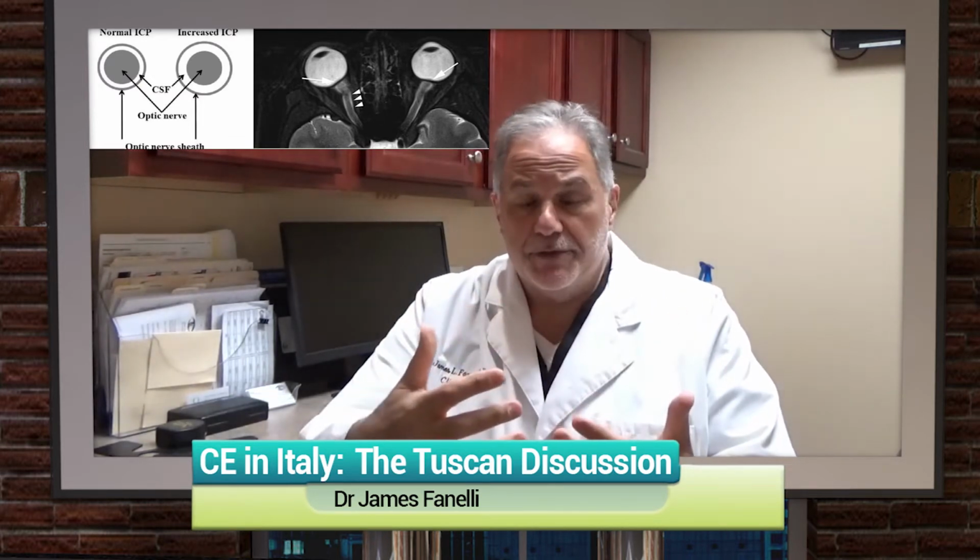So if we take a look at an MR image of a patient with increased intracranial pressure, we know that increased intracranial pressure can be caused by a variety of issues. This could be vascular, it could be venous sinus thrombosis, it could be a subarachnoid hemorrhage, subarachnoid leak.